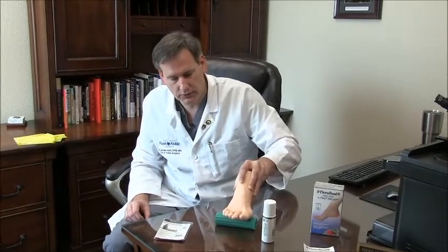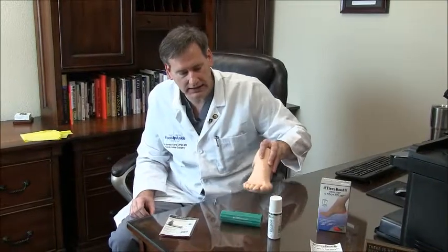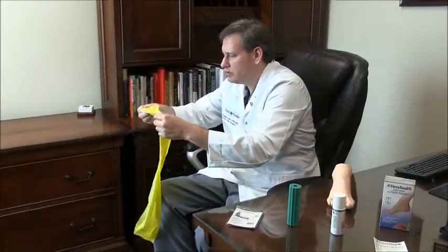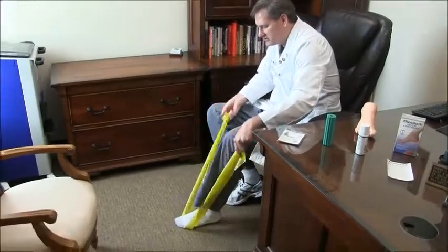Then, when the news program goes back on, you just go back and forth. Finally, we've got a TheraBand. I recommend things like beach towels, TheraBands, ropes. I'm going to show this TheraBand to you. What you do for a stretching exercise, you use this TheraBand.